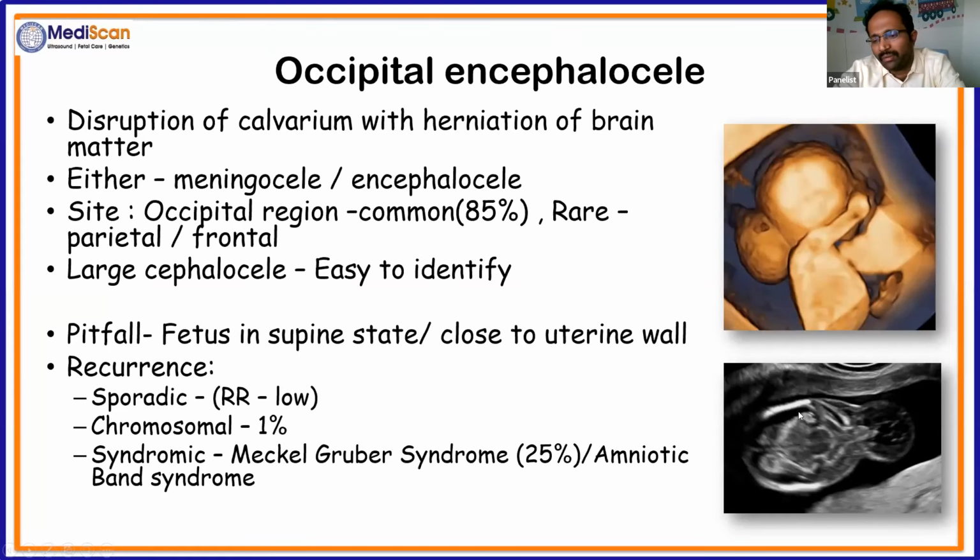However, if you have a baby having a very tiny cephalocele, not as big, probably one-fifth of the size of this, and the baby is lying flat against the uterine wall in a supine position, then we may not be able to identify this, and hence we need to look for alternative signs.